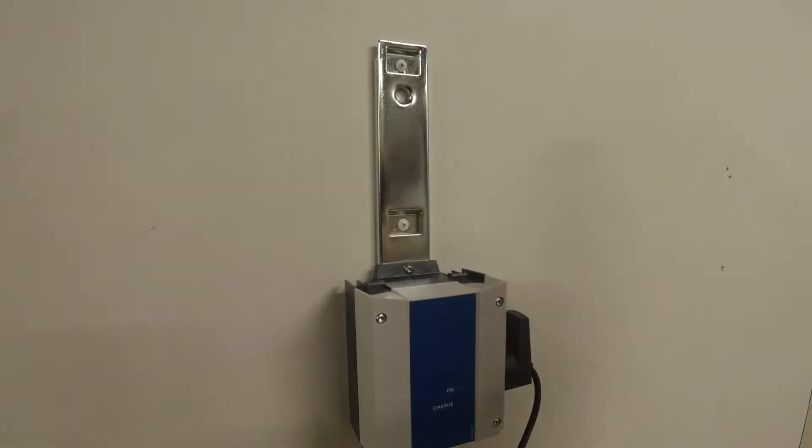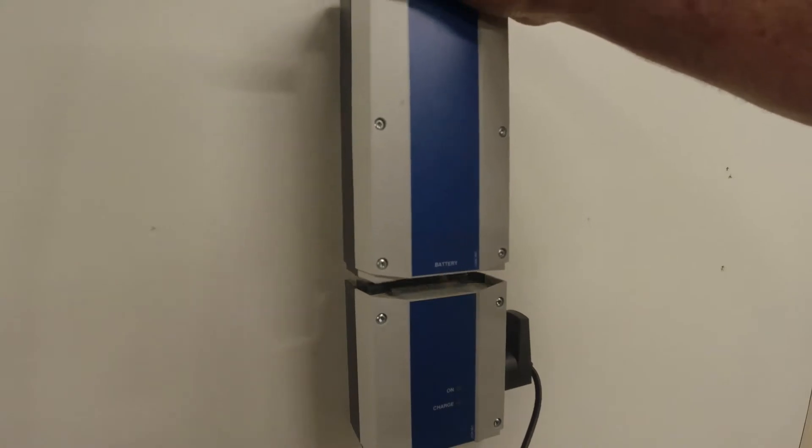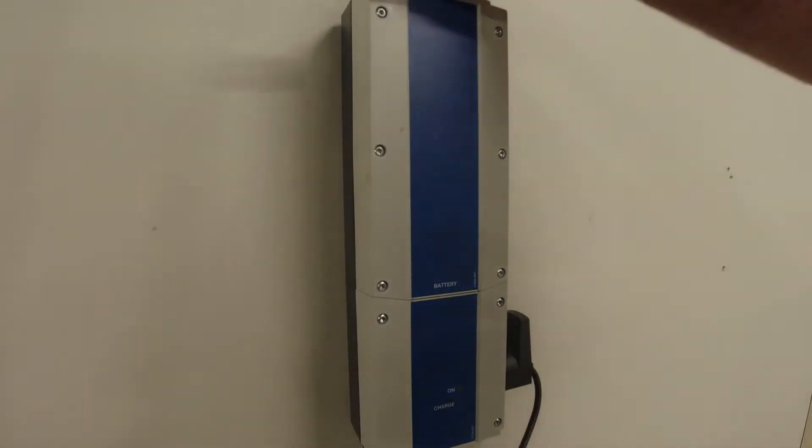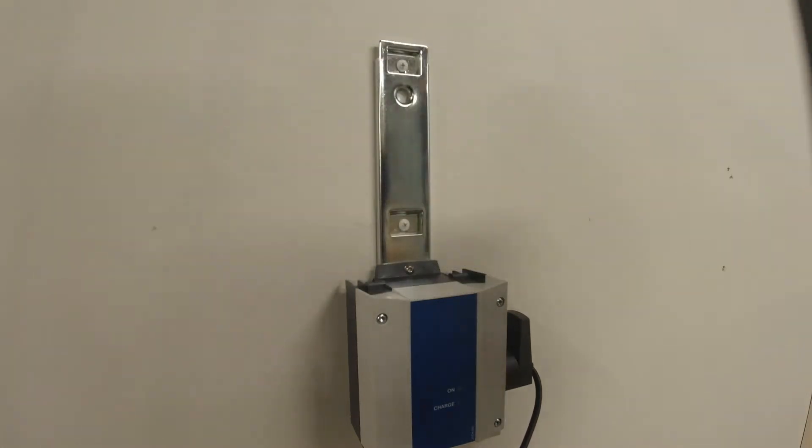After use the battery should be placed on the charger to ensure it's fully charged when required. This is the only item that is 240 volts, so most sites will position the charger in their office away from water.